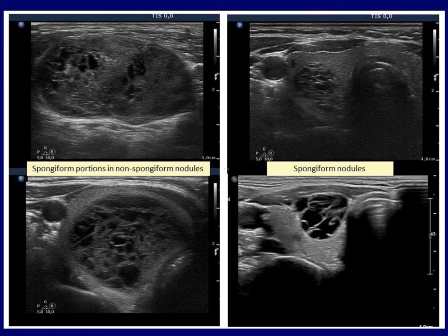The case on the left is by no means a spongiform nodule, as we see spongiform areas in only a very small part of the lesion. Although small cystic chambers can be seen in most parts of the nodule, in contrast with the spongiform pattern, they are mixed with solid parts. In the right cases, the spongiform areas exceed 50% of the nodule, so these lesions can be classified as spongiform nodules in all guidelines except the European Thyroid Association.